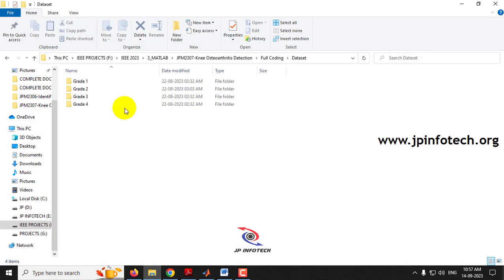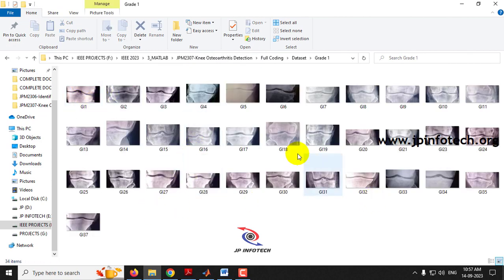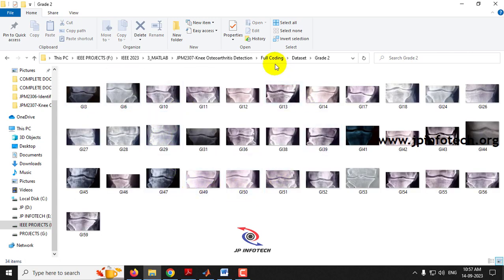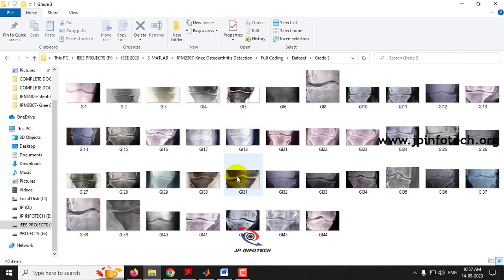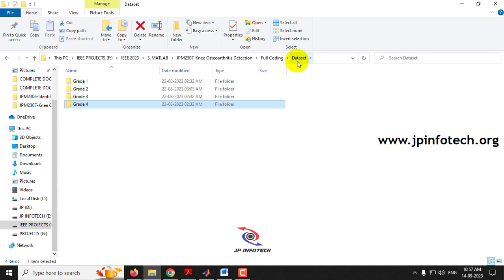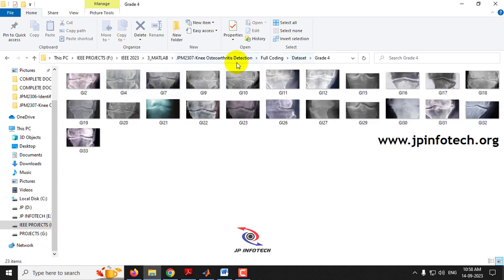Let me show you the dataset. In the coding folder, we have the dataset with grade 1, grade 2, grade 3, and grade 4 subfolders. Here you can see sample images of each grade that we use to train the system. The grades are classified for knee osteoarthritis as follows: grade 1 means doubtful, grade 2 means mild, grade 3 means moderate, and grade 4 means severe. Now let us see the execution of the project.